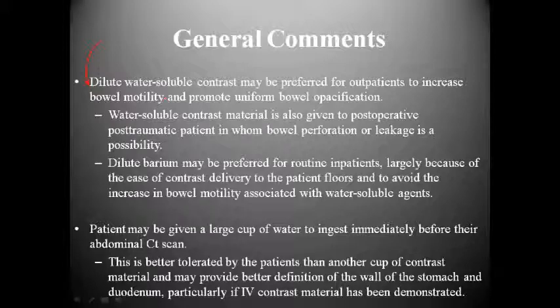And so a lot of facilities sometimes favor the dilute barium just simply because of the decrease in the possibility of there being an increase in bowel motility, I guess you would say.